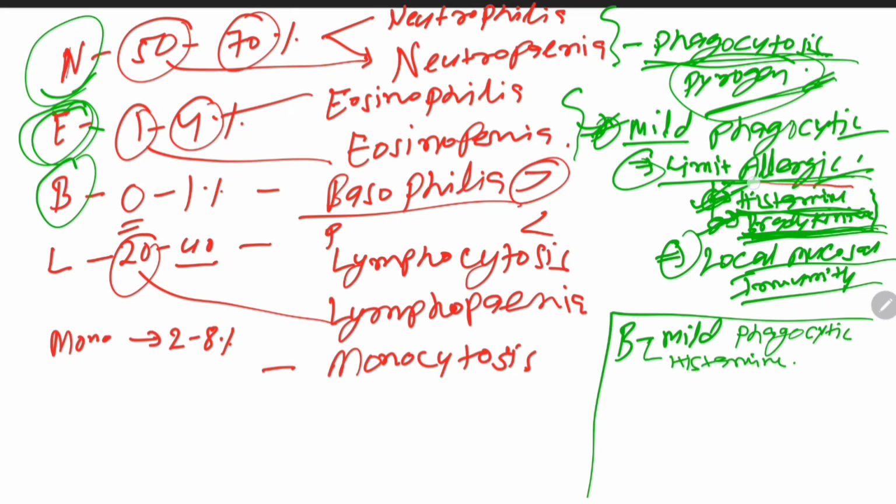Here we can see eosinophil actually degrades the histamine, and here basophil liberates it. The basic function of basophil is to release histamine, and eosinophil chemotactic factor of anaphylaxis will be released, and they will produce what type of reaction? Skin reaction, or you can say allergic reaction of the skin. This is also allergy and anaphylaxis.